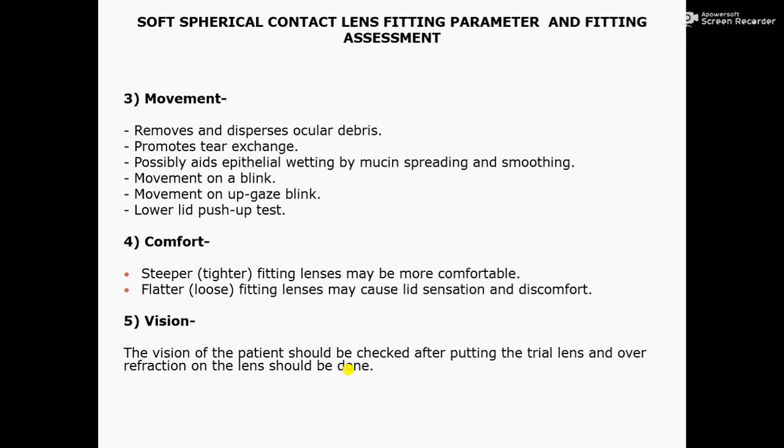Number 4, comfort. Steeper fitting contact lenses may be more comfortable, and flatter fitting contact lenses may cause lid sensation and discomfort. Number 5, vision. The vision of the patient should be checked after putting on the trial contact lens, and over refraction on the lens should be done. Thank you.